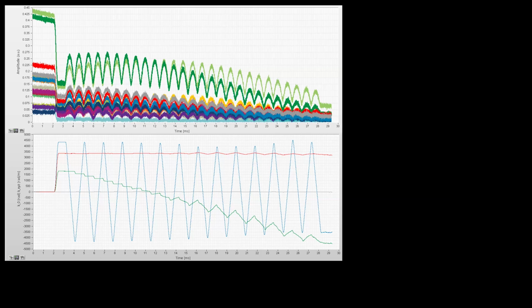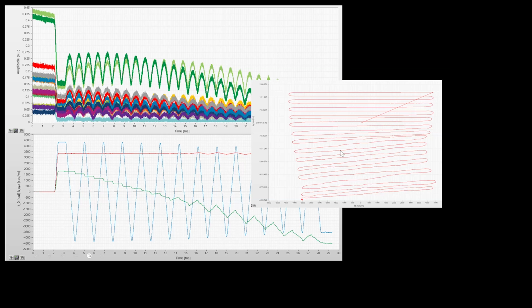So if you see here, these are the dynamic field camera trajectories that we are obtaining using a field of view and slab encoding field of view equivalent to what we would use in the whole human brain. You can see just the raw FIDs coming off of the field camera, that they're actually starting at fairly low amplitudes and they were all offset from each other. And that basically leads to loss of signal and unreliable trajectories, which are also illustrated here.